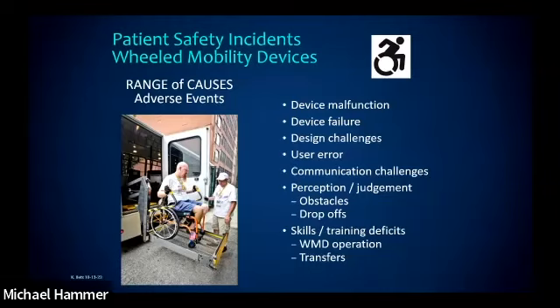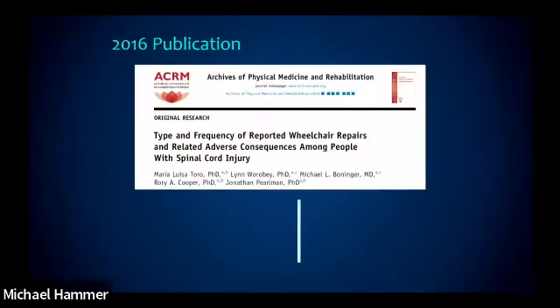Okay, so if we're not teaching strong wheelchair skills, whether it's driving or propelling or jumping that curb or getting up a ramp without flipping over backwards, we will see individuals that sustain injuries as a result of that consequence. So just a wide range of causes of why people get injured using those devices.